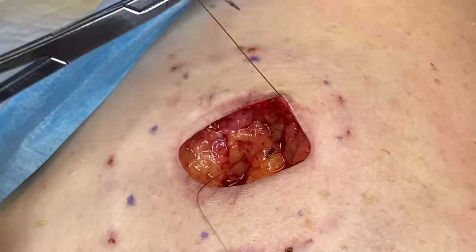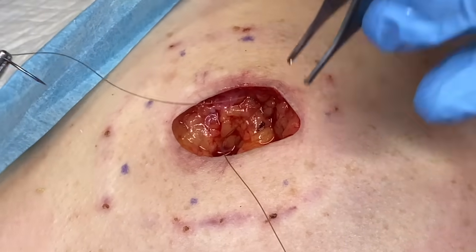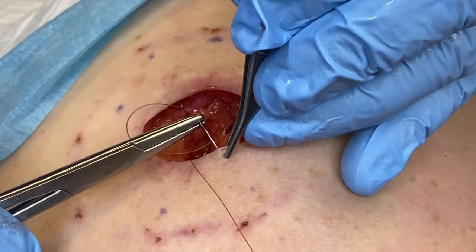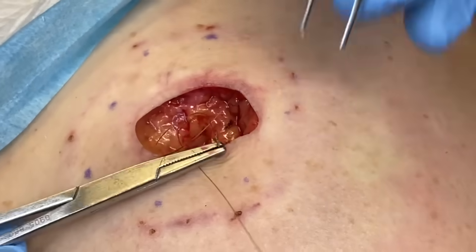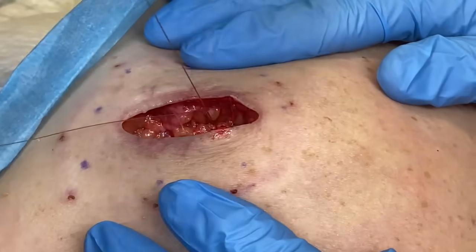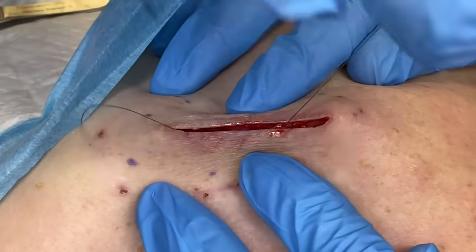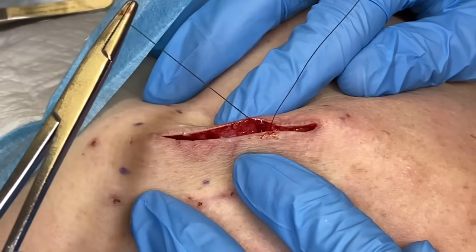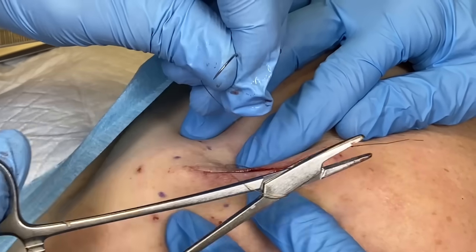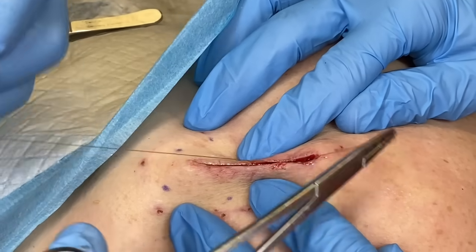While that becomes really relevant when you're doing a lot of plastics procedures, for this it's more about just adding a strength layer. If it was slightly off, the only difference is this would gape a little bit, but we don't care so much because we're adding a layer on top of this, which will close this up. Realistically, we just want this to help carry all the weight. This one you tie like a normal knot: one loop, pick it up and close. You don't pull too hard or you'll rupture the suture material, and then cut right on top of the knot.